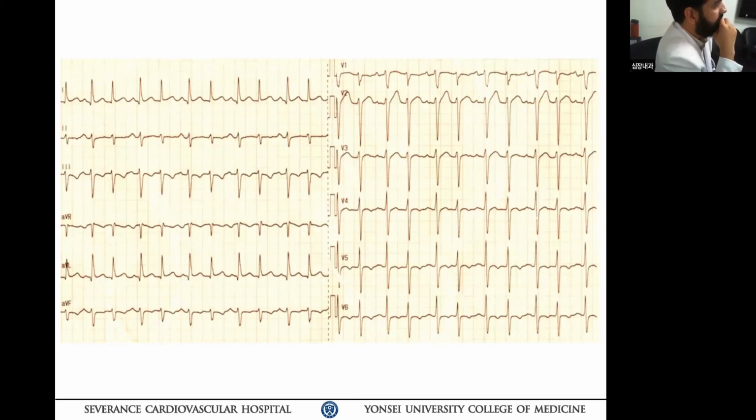Just count the scale. It's more than 600 milliseconds, right? Yeah, it's around 500. Five or 600 milliseconds. 200, 400, so maybe actually 580. Currently the fellow is measuring the multiple intervals by utilizing Dr. Zhang's calculator. It's about 560.